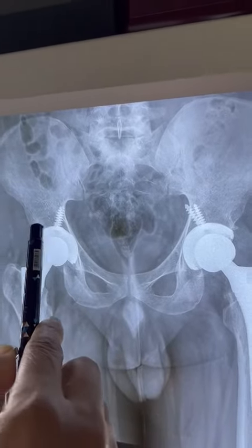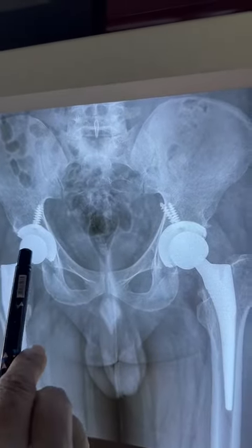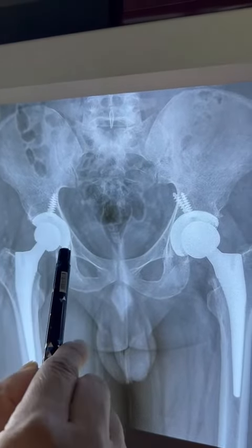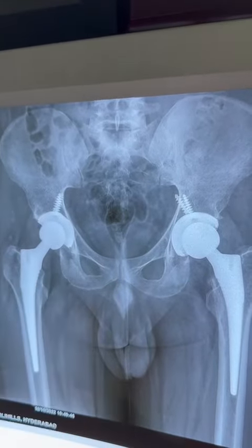The right side has a ceramic head and an uncemented cup, fixed with two screws. We can also use a cemented stem with a cemented cup, or a cemented stem with an uncemented cup — the latter is also popular when the acetabulum is osteoporotic.